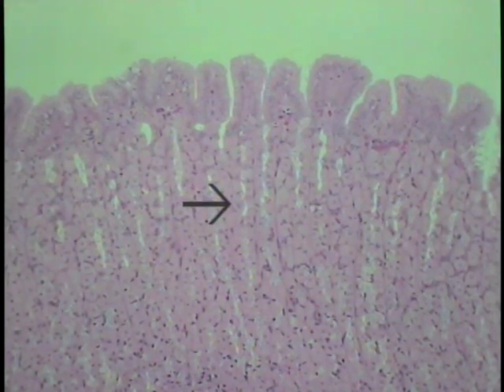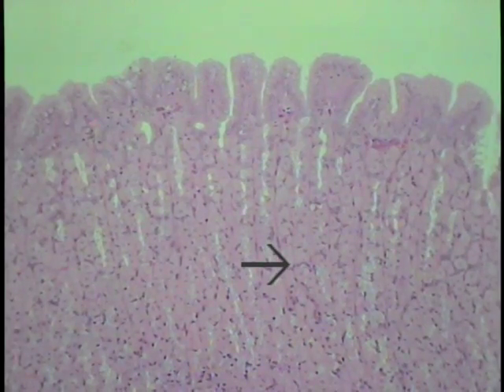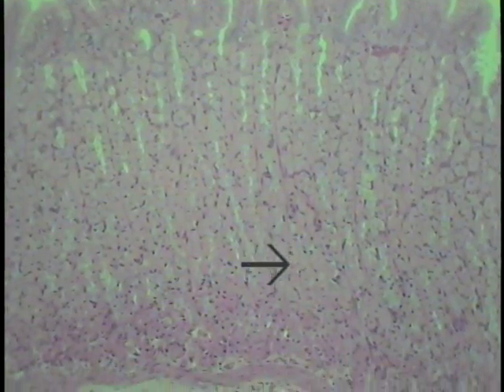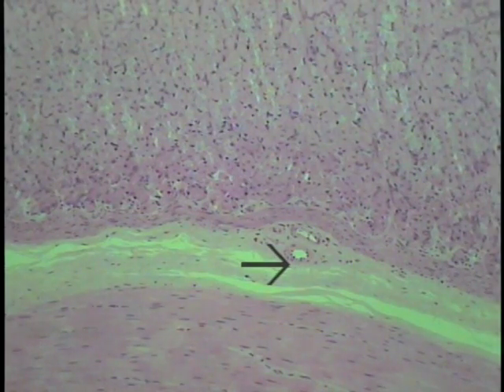Even at this low magnification, an abundance of parietal cells can be visualized, these large round ones, as well as other cell types in the background. The lamina propria can be seen barely, sort of obscured or forming around the well-developed oxyntic glands. So that is the mucosa of this region of the stomach.